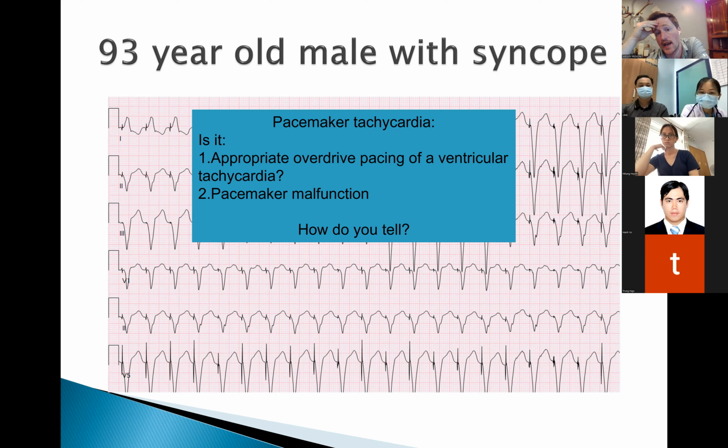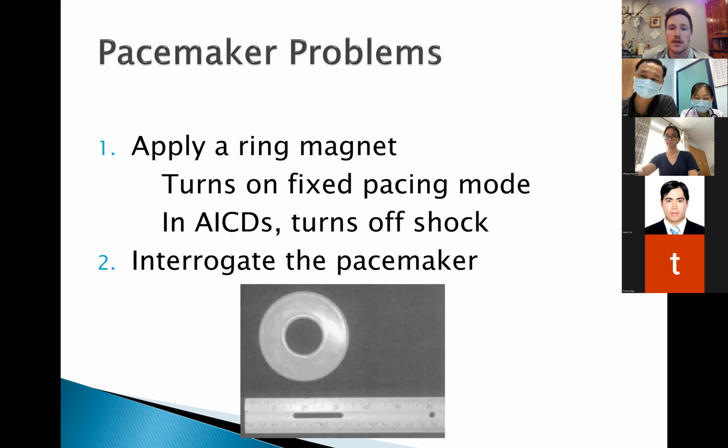So again, is it an overdrive pacing of a ventricular tachycardia, meaning that it's a ventricular tachycardia, or is it a pacemaker malfunction? And how do you tell? Well, again, I think it's quite difficult. And this is where I would have Scott Youngquist help me with this, because this is definitely not my expertise. But one way to tell would be to reset the pacemaker back to its native function. So this is where you apply a ring magnet.